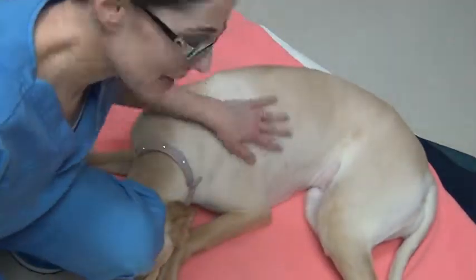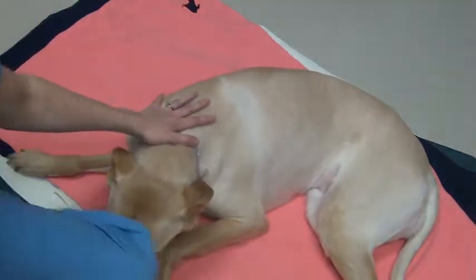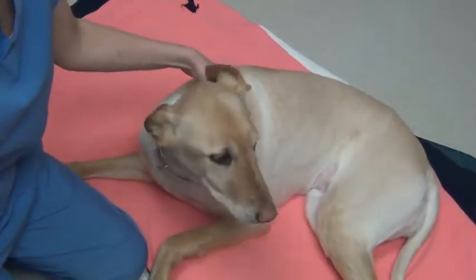Hey, it's Leslie Schmidt. I'm here today to show you how to do a modified Robert Jones bandage on my dog Daisy. I washed my hands before I got her out, and I do have all of my materials ready. I've got porous tape for my strips. I have 2 pieces of that. Those are for my stirrups.